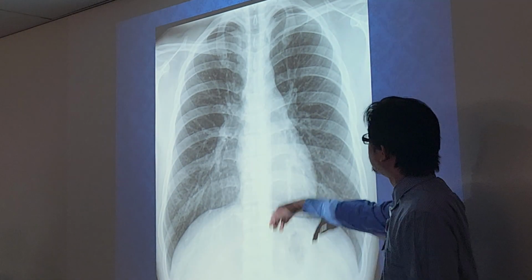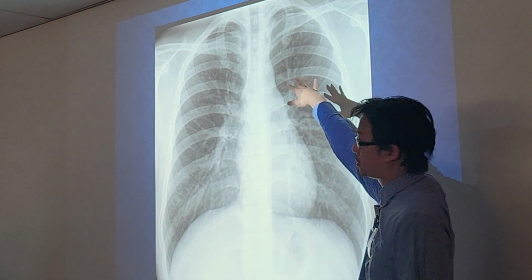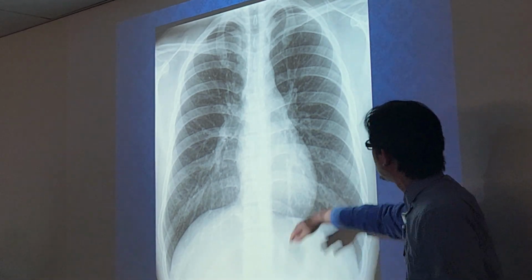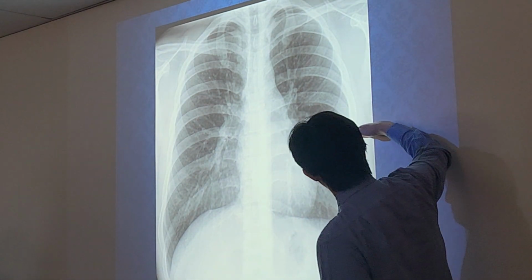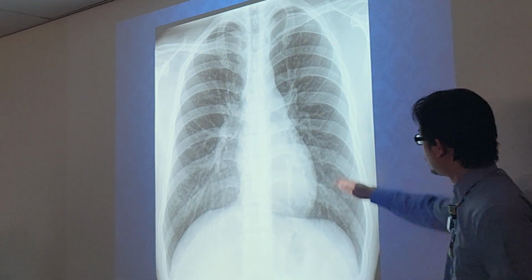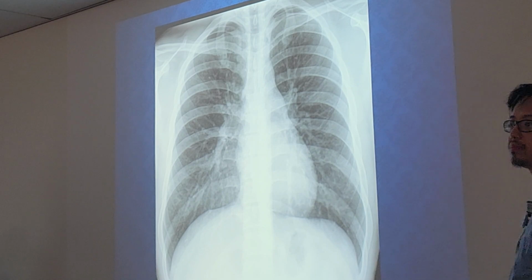So do you have an AP? On an AP, clavicles are going to be higher. You're not going to look over there like T3, T4. They're going to be all the way up at like T1, T2. And then your ribs are going to come this way and then they're going to come straight back. In fact, they even sometimes curve back up a second time. It looks really weird. That's why I said ribs confuse me.